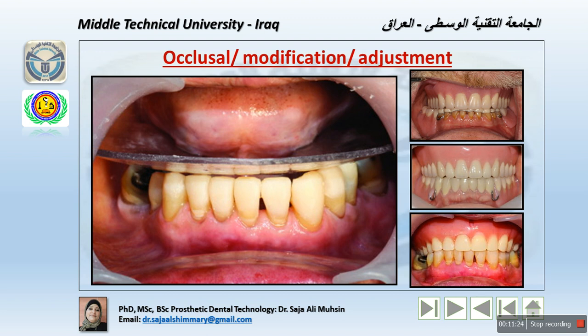Now then, make a protrusive record and set the horizontal condylar guidance, that means the condylar angle. Then we set the upper artificial teeth one by one on the denture base and adjust the lower occluding stone teeth by scraping in order to establish a harmonized occlusion plane.